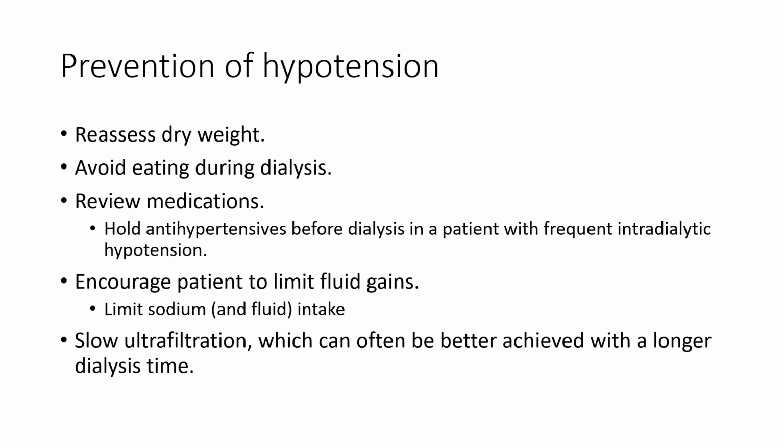How can we prevent intradialytic hypotension? Well, first we need to frequently reassess dry weight. Maybe the dry weight's too low and needs to be raised. Encourage patients to avoid eating during dialysis. This shunts blood towards the intestines and that can lower blood pressure.